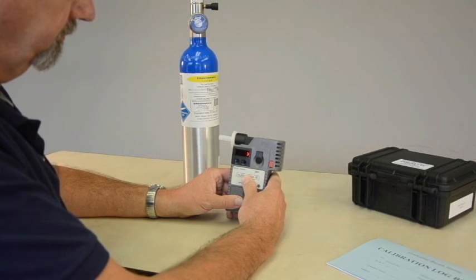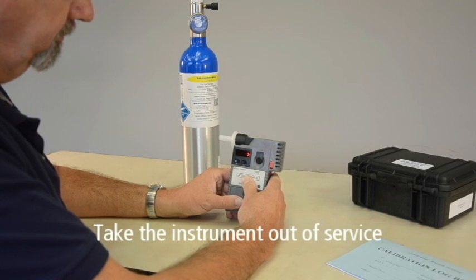It is important to note if your instrument cannot maintain accuracy within an allowable tolerance following a calibration, you must take the instrument out of service and have it evaluated and serviced by a factory trained technician.